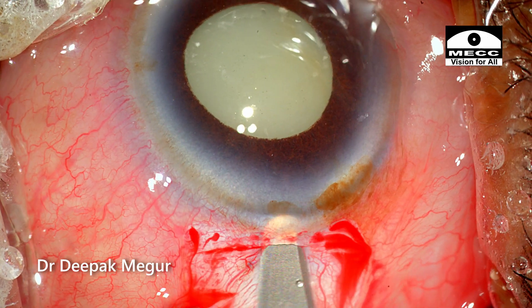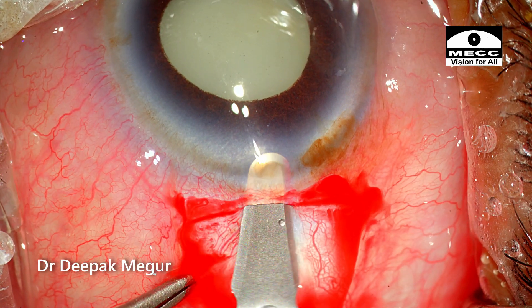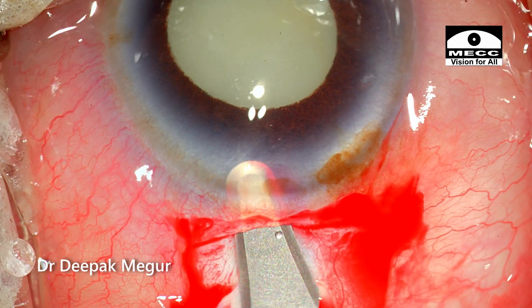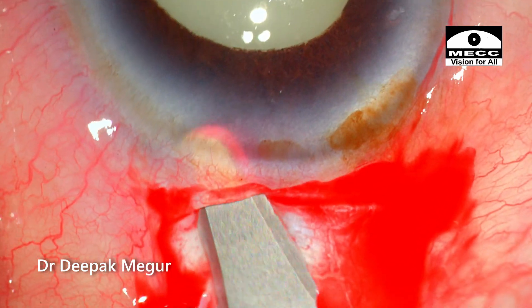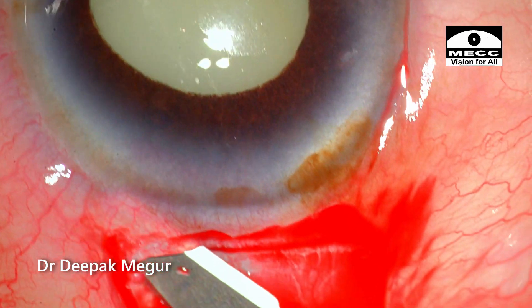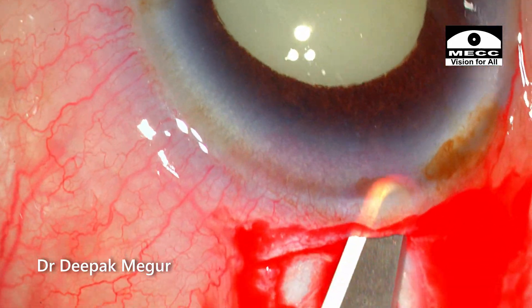A crescent blade is used to create the scleral tunnel. I begin in the center, go into the cornea for about 1.5mm, and then the tunneling is extended laterally to the left. Please note that the blade will be slightly tilted to compensate for the change in the curvature of the globe as I tunnel in the lateral aspect of the incision.